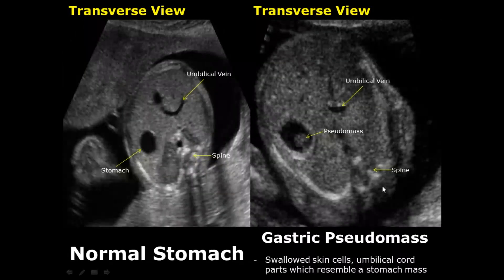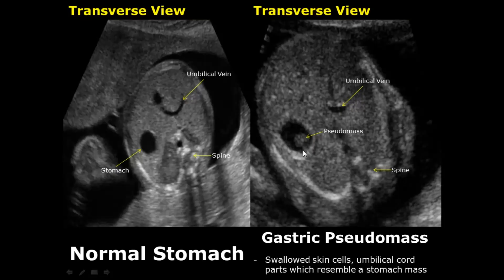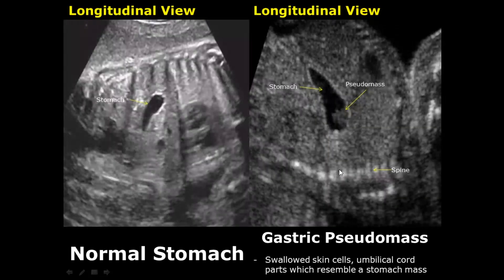A gastric pseudomass occurs when the fetus swallows skin cells, umbilical cord parts, or even blood, which may resemble a stomach mass. But it is not a stomach mass — these are just swallowed materials which look like a mass or a tumor. Here is a longitudinal view of the stomach; it appears elongated and here is the fetal spine. The stomach is simply fluid-filled and there is no swallowed material.